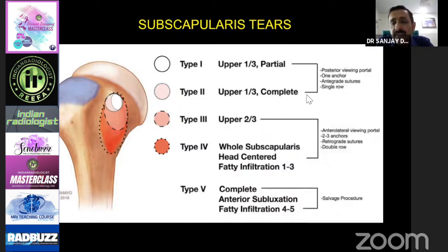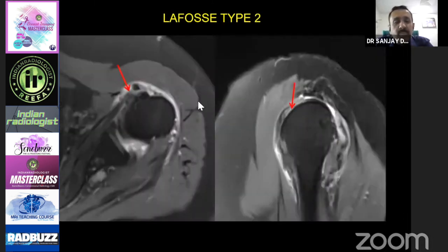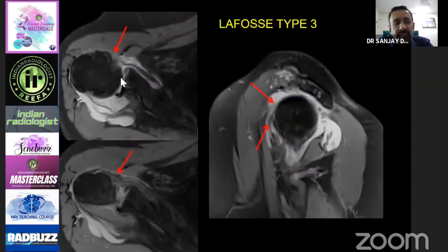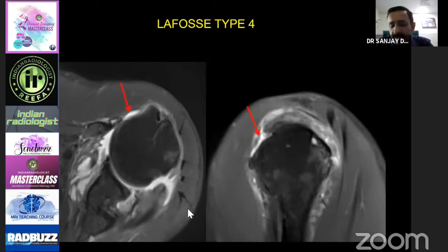This is an example of Lafosse type 1 — partial thickness tear involving only the upper portion of the subscapularis. Type 2 is full thickness tear involving only the upper portion. This is type 3, involving almost upper two-thirds with the lower portion still intact. Type 4 shows a complete superior-to-inferior entire subscapularis tear, causing the humerus to sublux anteriorly. In infraspinatus tears, the humeral head subluxates posteriorly.